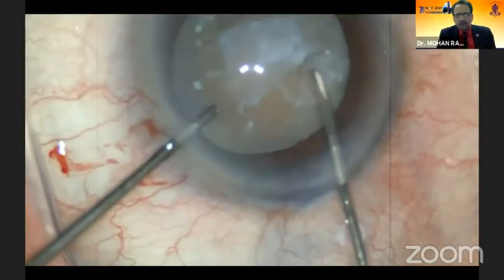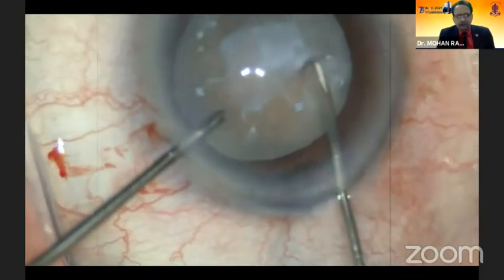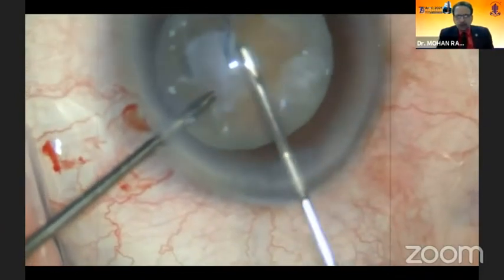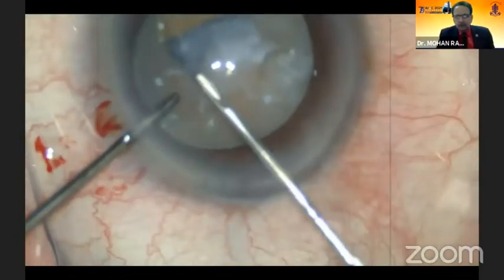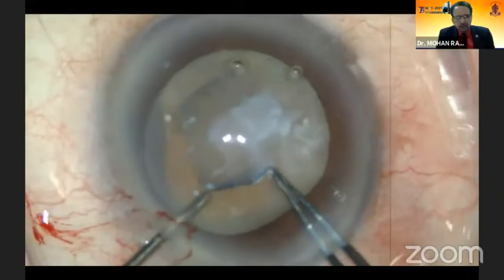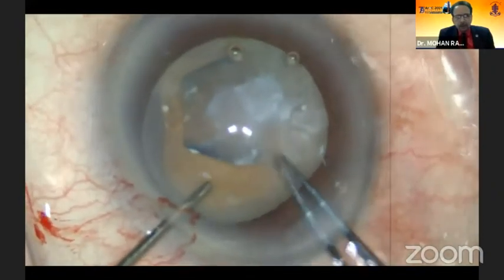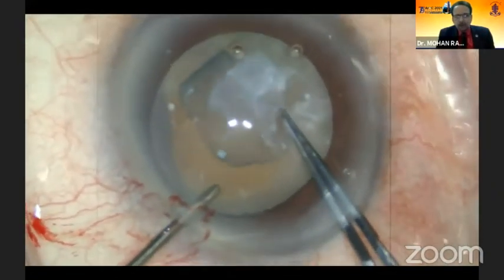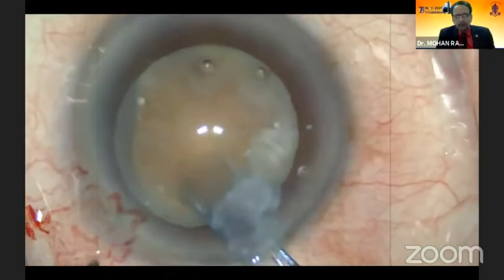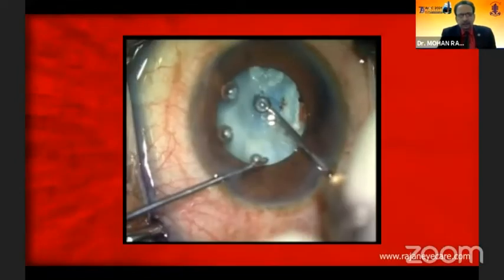You can see these sort of cataracts are very, very common post-vitrectomy, with a calcified anterior capsule. You can see the zonule. As soon as I make the rhexis itself, you can see the lens is moving around, the subluxation of the lens, the phacodonesis, which is not very uncommon. And you can see here that I'm using the capsulorhexis forceps to make sure that the central fibrotic element is taken care of as well.